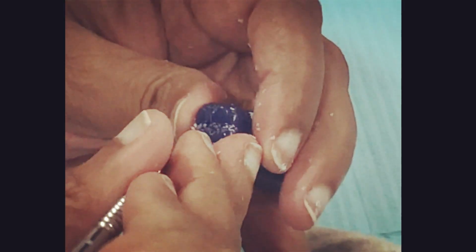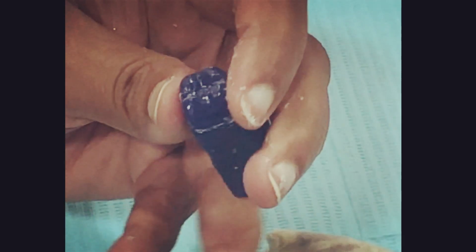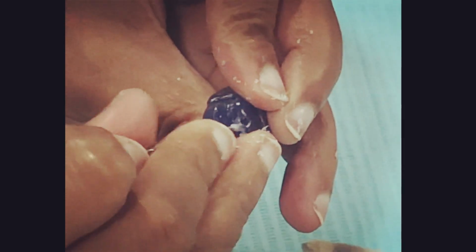Again, I'm carving the cusps. This is the main part. Your cusps should look nice and carved and pretty.